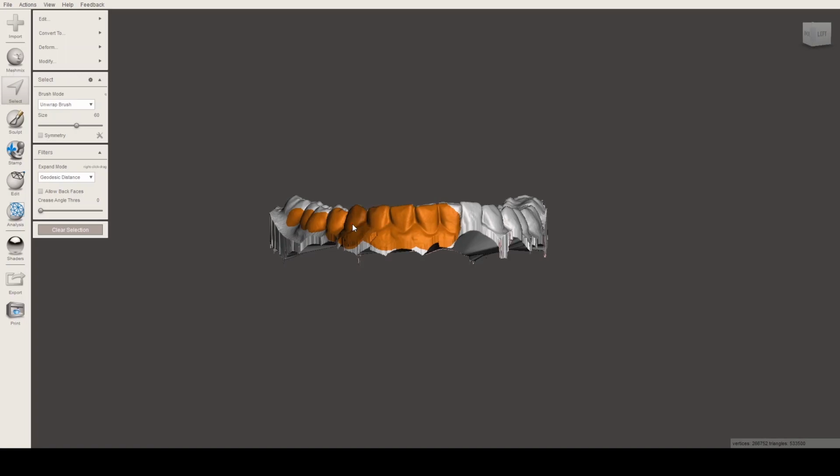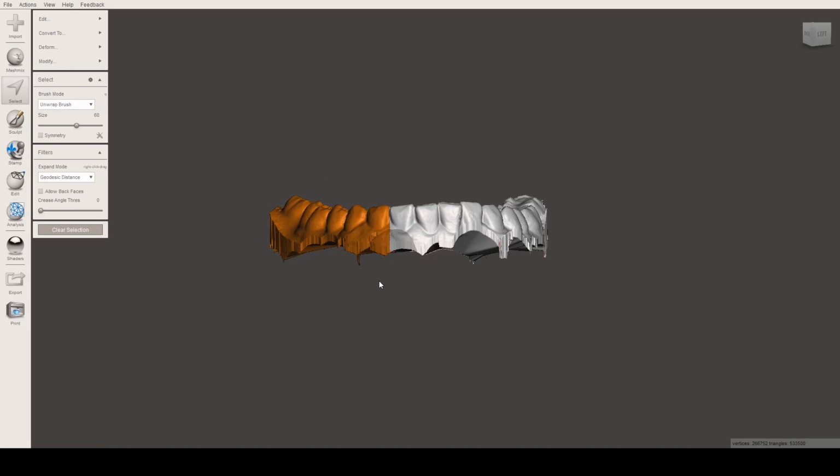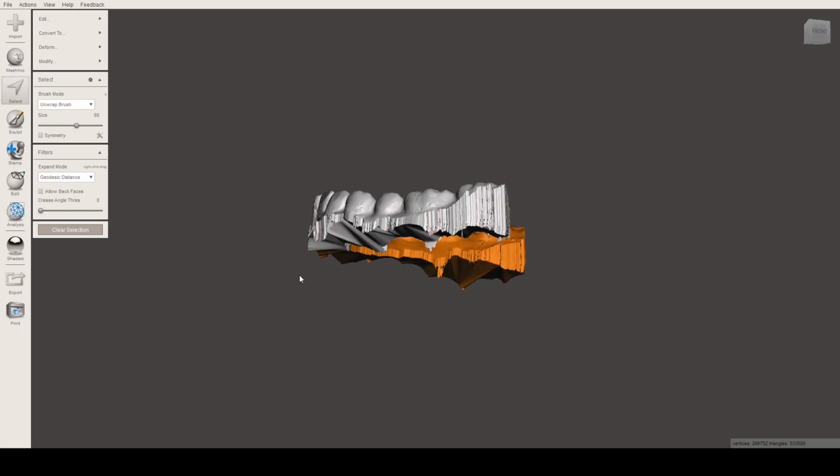And another way to select things, actually, let's deselect first, is the line select or the point select, where you just click a line there and it will select the portion of the object. So you can select the whole half of the area, if you want something more precise, or if you want lines to be incorporated into your selection. You can use the line select or the point select. You can just click here, and then basically that's it. Just throw a box and it will select the portion inside that area.